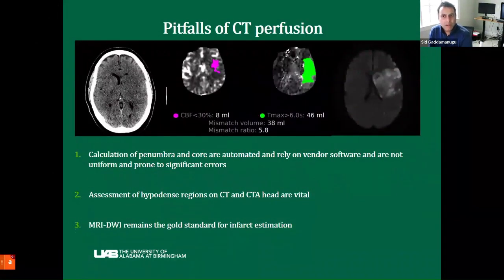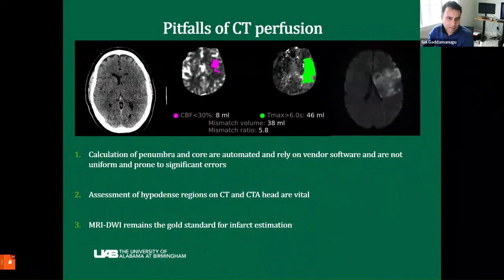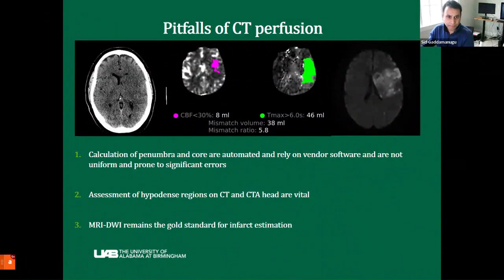But remember that there are a lot of pitfalls in CT perfusion. We see them time and again. These rely on vendor software, and they're not accurate. They're definitely not accurate. Okay.